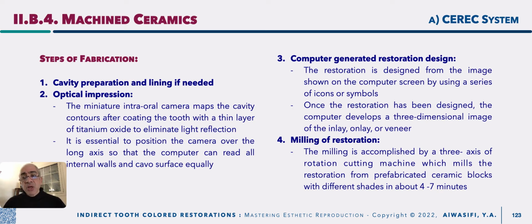The ceramic block is checked for color matching with the tooth before holding it or before uploading it to your machine. Okay, and the procedure all in all may take from 4 to 7 minutes according to your system.